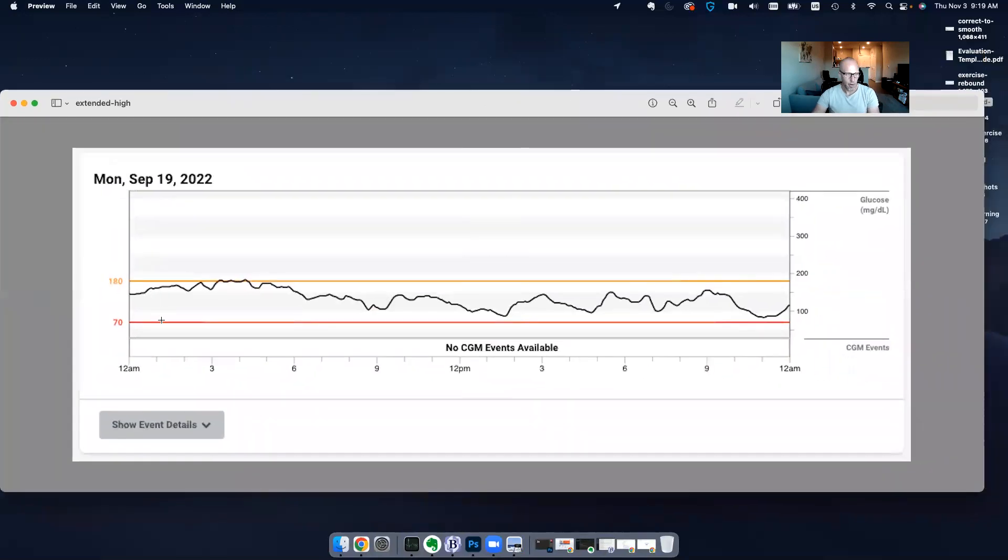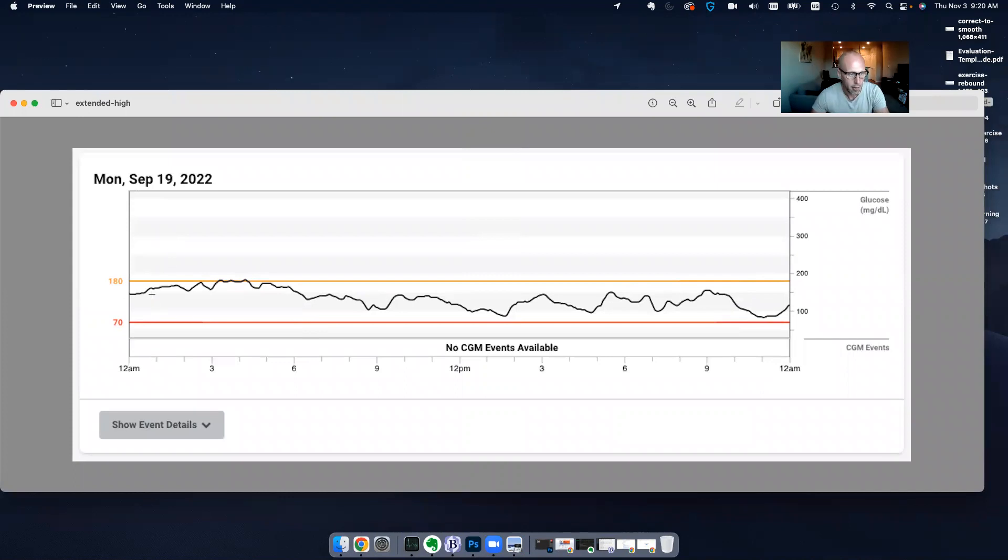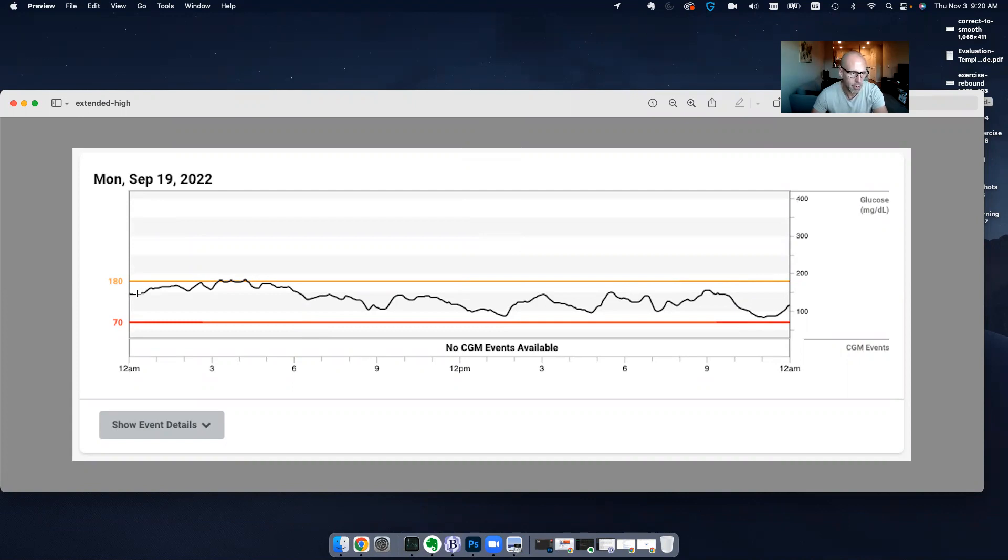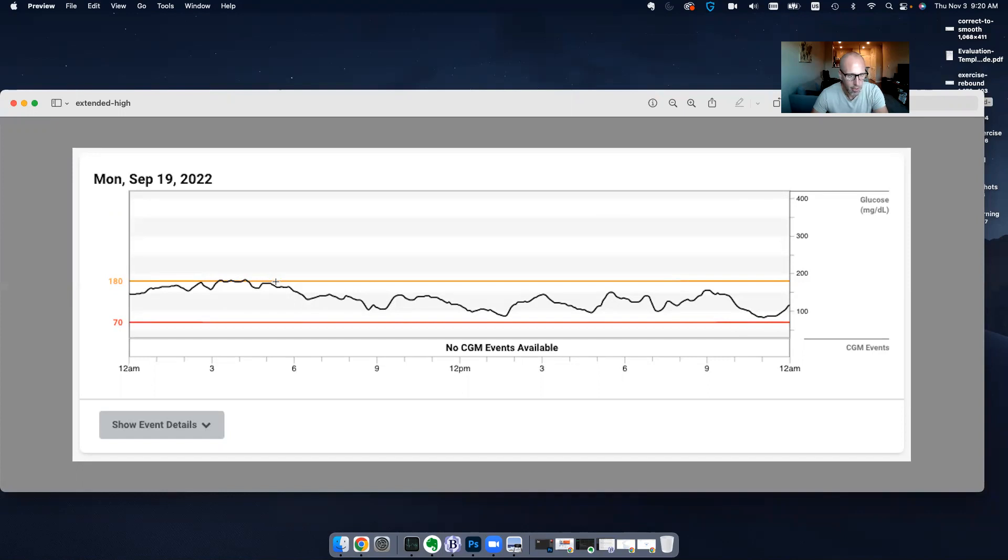So the first graph that I want to show is an extended high. This area where I have my cursor, you can hopefully see that little plus sign on the left. This is what I would call an extended high.